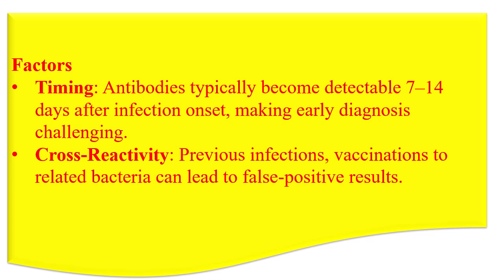There are some factors which may affect Widal test results. In timing, antibodies typically become detectable 7 to 14 days after infection onset, making early diagnosis challenging.